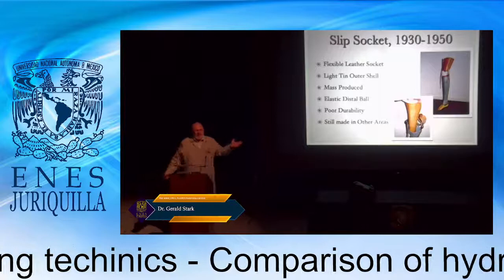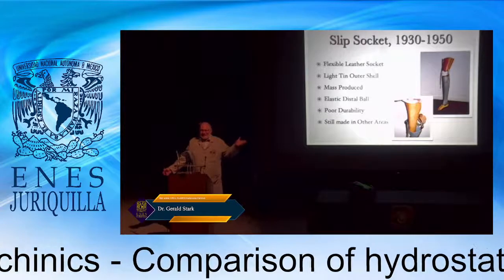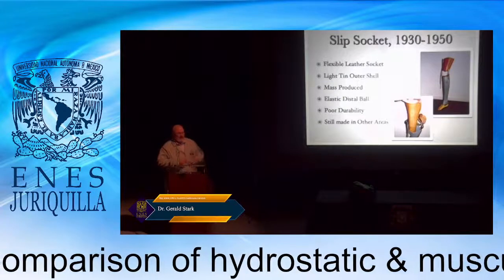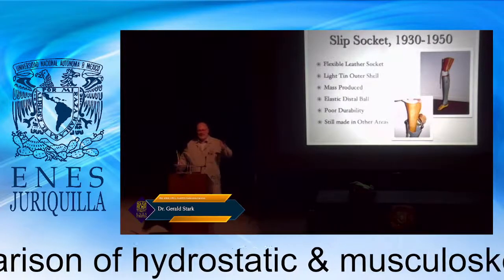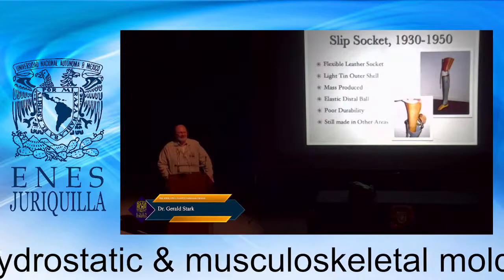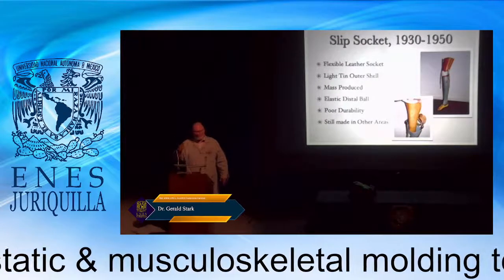Now you could think, well, this is 2021, and by the way, your lecture is very boring. But the thing is that slip socket, that elimination of shear, is present in the same sort of theories with vacuum systems, which we'll cover later. So all of these things are in different forms in history.